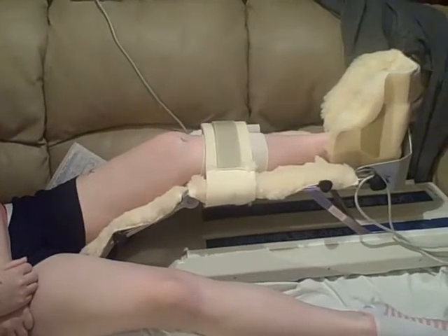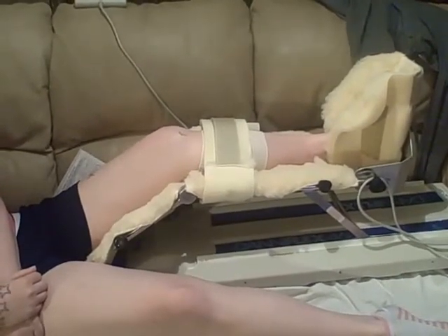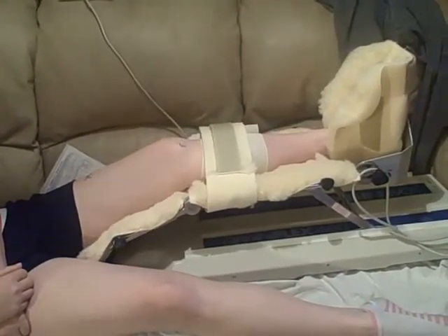Typically the range of motion can be increased by about five degrees a day as the person can tolerate it, so that they are increasing range of motion on a daily basis.